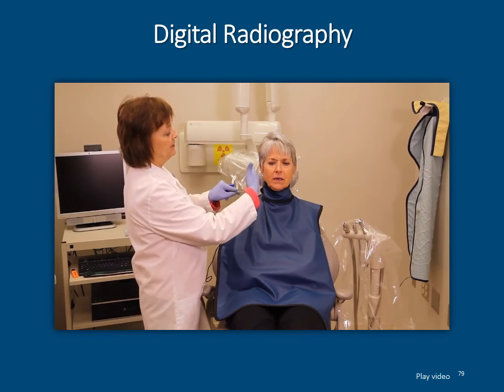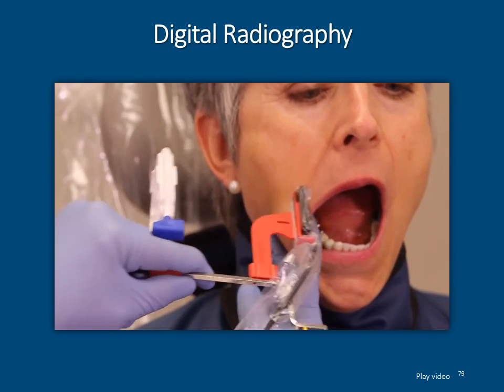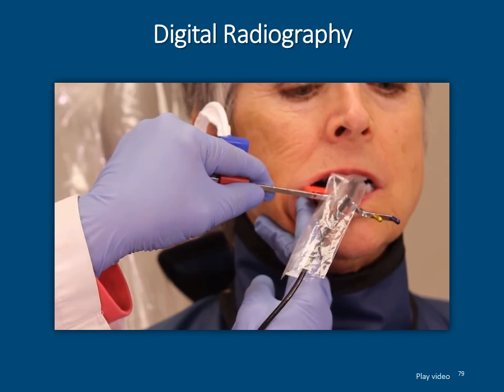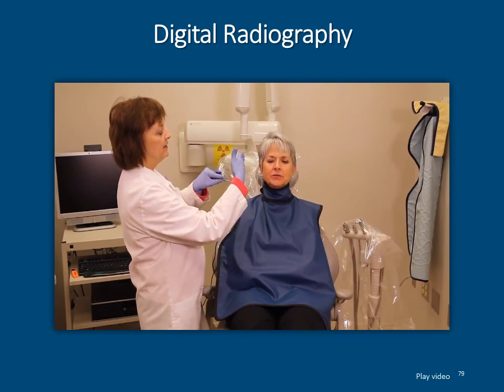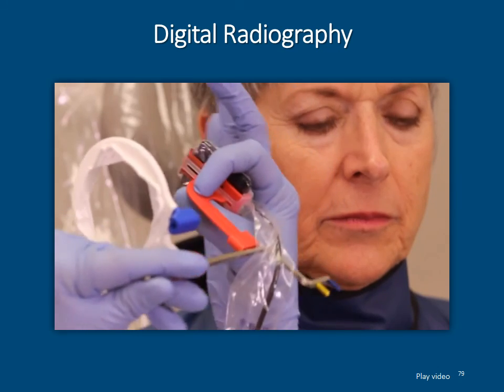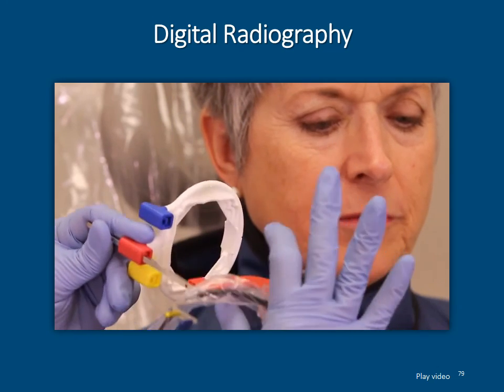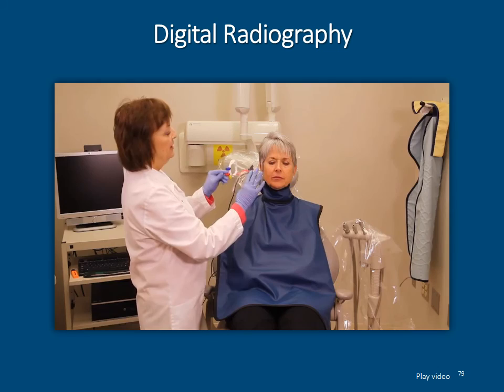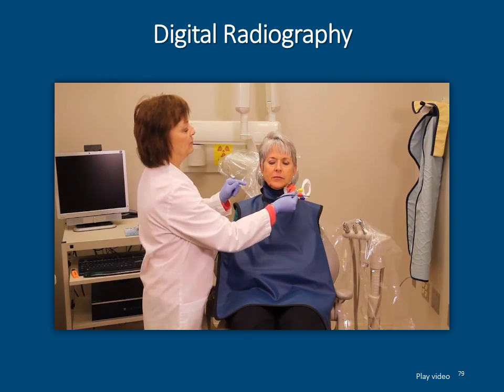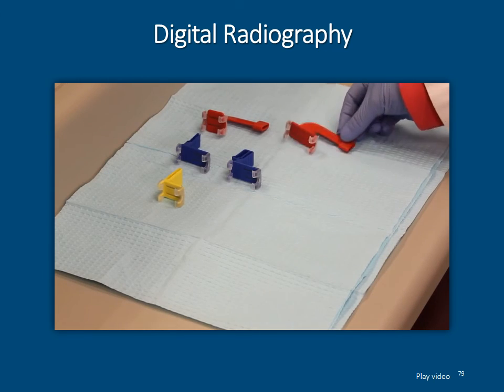Placing this, it's best to put the film, or the sensor, closer to the middle of the mouth. Track the cheek, slide it way back there, and have the patient close and bite. Open. By allowing the sensor to be more towards the middle of the mouth, the patient is able to reach down and bite right to the bite block and have no separation between the teeth. Usually bite wings are pretty easy. So the two on one side and then the molar and premolar on the other side, and you're good to go. Next step we'll do is the anterior PAs.